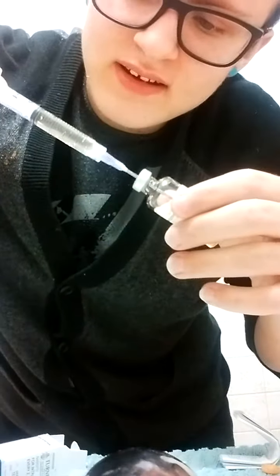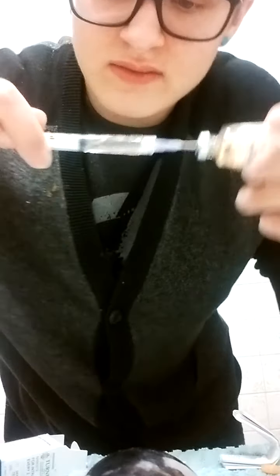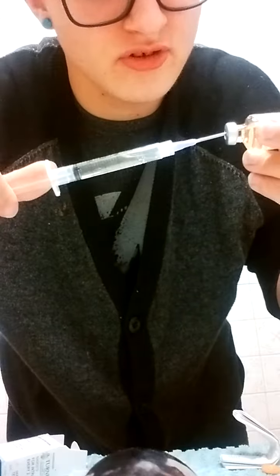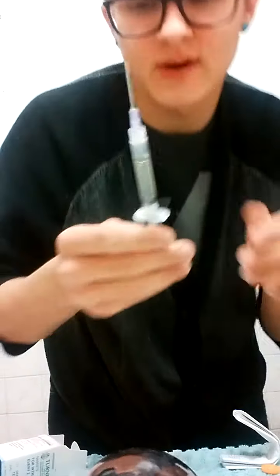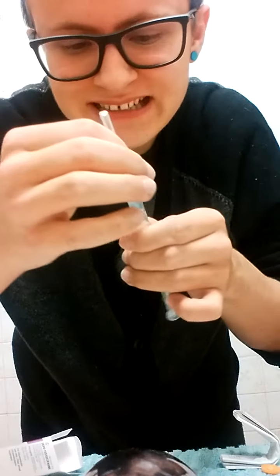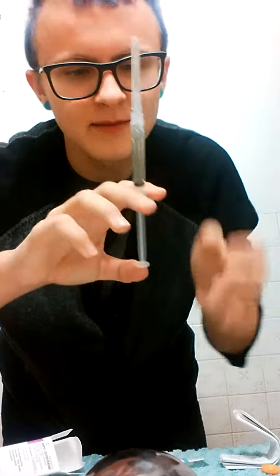I like to pull it extra when there's nothing in it, so there's more air in it. When I un-pull it, I know I have what I need, and then I cap it. Yes, there will be air in it, but I like that because then I know it's good.